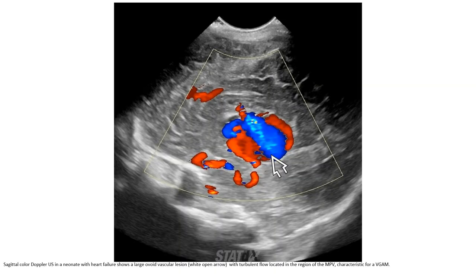This is an ultrasound in a neonate with heart failure, showing a large anechoic region with turbulent blood flow located in the region of the vein of Galen, characteristic of vein of Galen aneurysmal malformation.